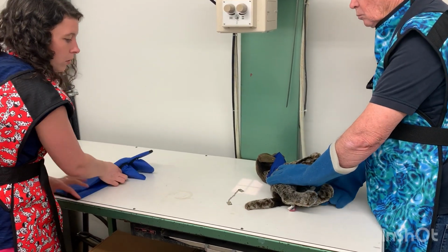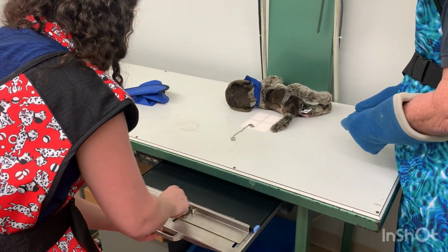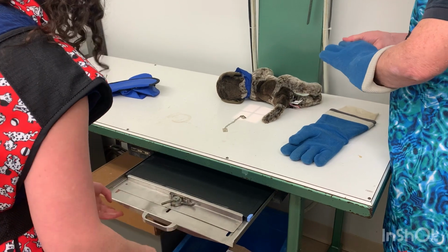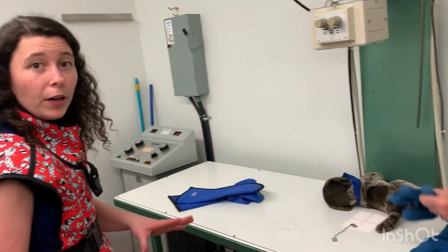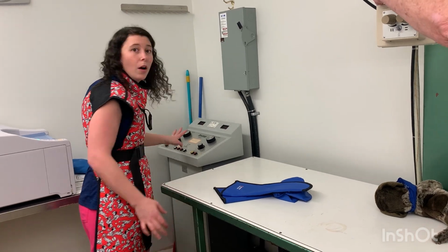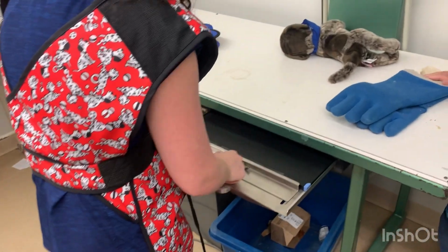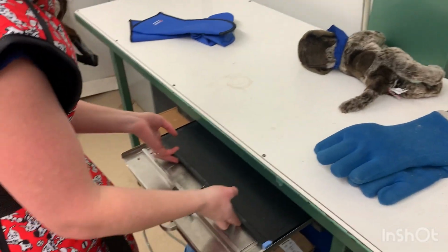Now what I need to do is take our PSP plate out because the latent image is now stored in it. We're not going to be taking any more radiographs right now, so I can turn off the collimation as well. And then we're going to take our PSP plate out.